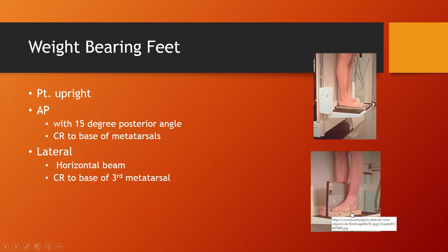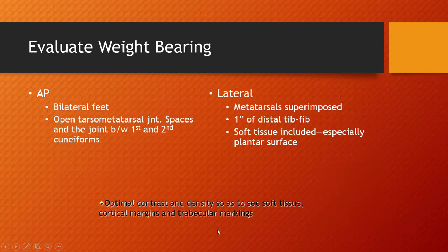You're going to build them up on a wooden block. And you're going to take a lateral on both sides. You're centering to that third metatarsal again. If you're going to evaluate your weight bearing, you're going to have bilateral feet on the same image receptor.